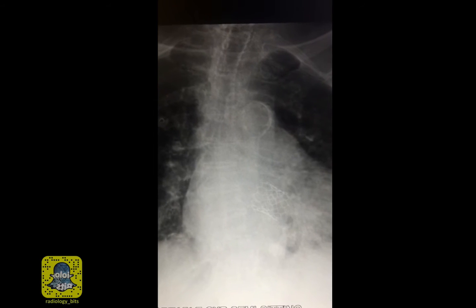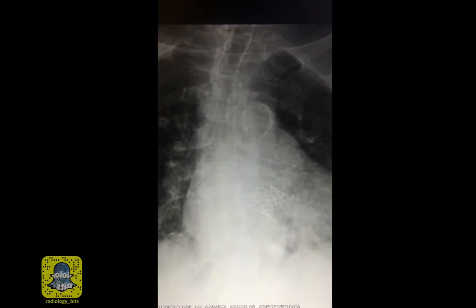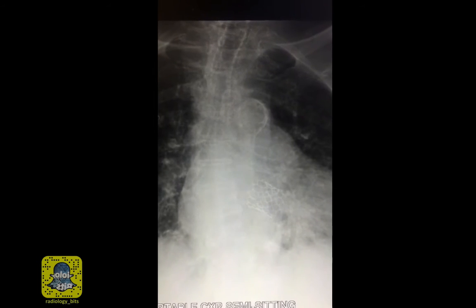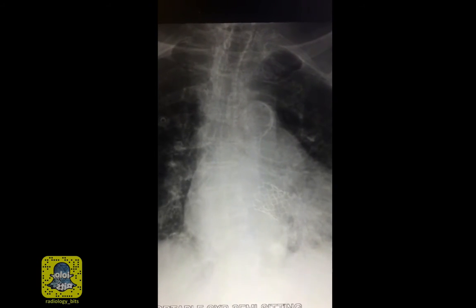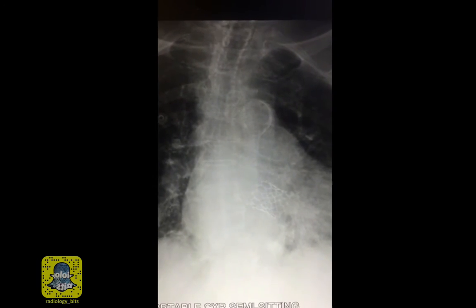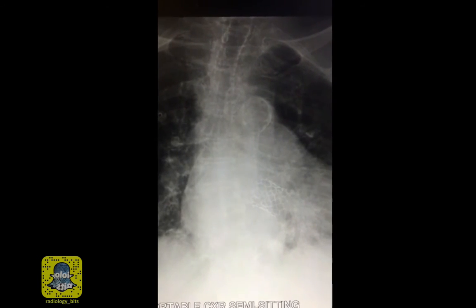And this led to what we're looking at now, which is insertion of the valve by non-surgical means. This option of inserting the valve in the catheter lab through a femoral arterial approach, where the operator uses the catheter to introduce this device, which is the stent, which is then placed in the location of the aortic valve to open it up and get rid of the stenosis.